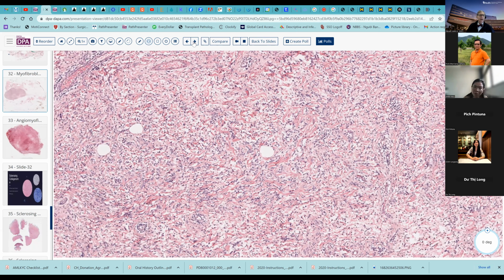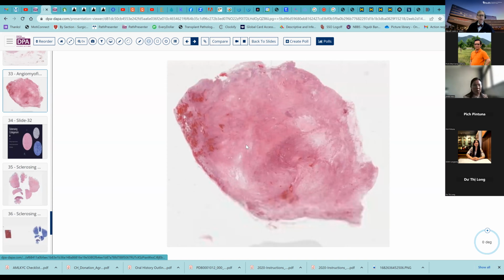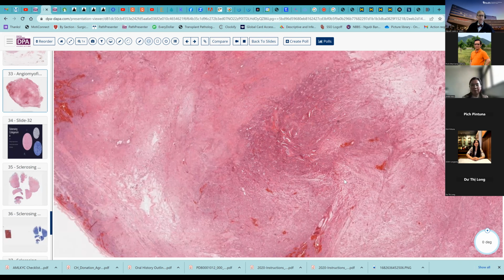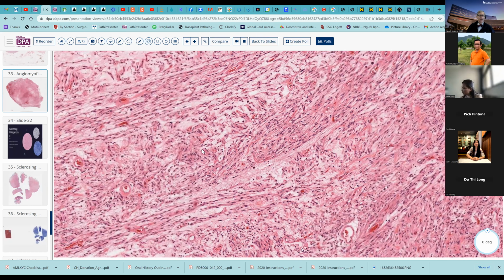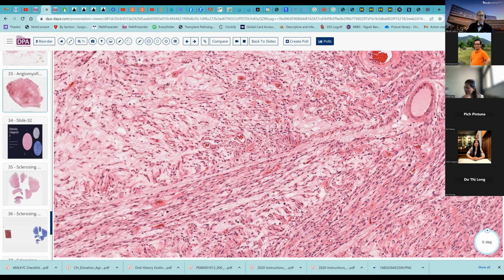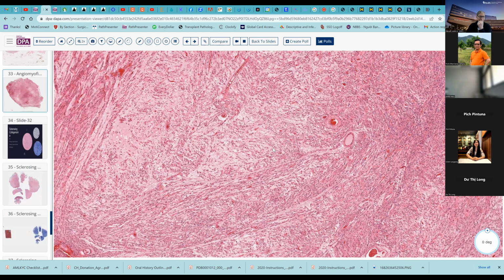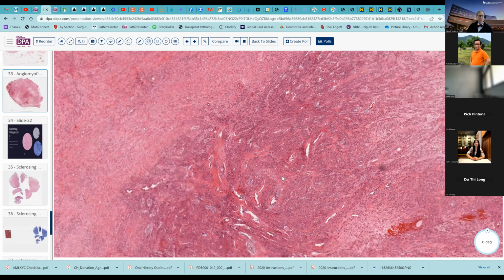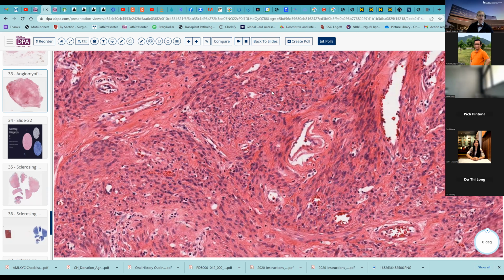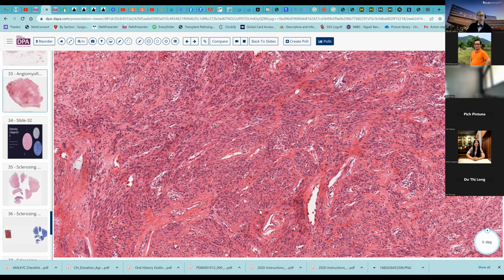Okay, well, we're just about done. I have one sort of final lesion to share with you. Oh, well, here's another example of the myofibroblastoma. Again, kind of very bland spindle cells, collagen, a little bit of myxoid change here. You can have associated fat within the tumor, more cellular areas here. Doesn't this look a lot like that solitary fibrous tumor we looked at earlier? Almost has a hemangiopericytoma-like pattern.